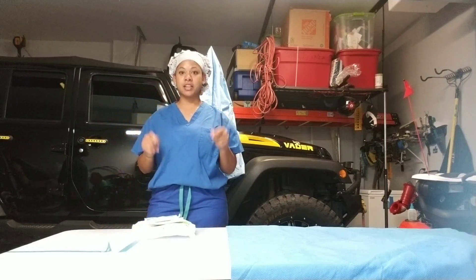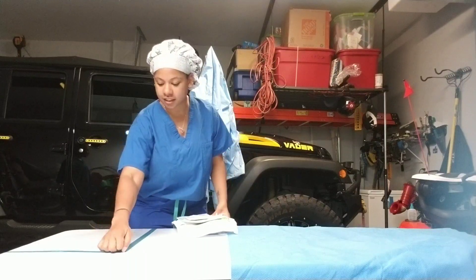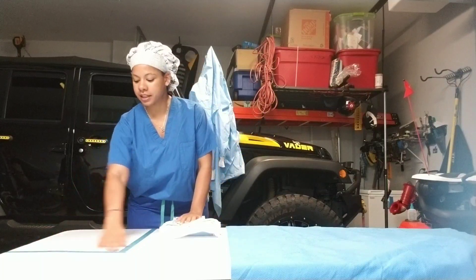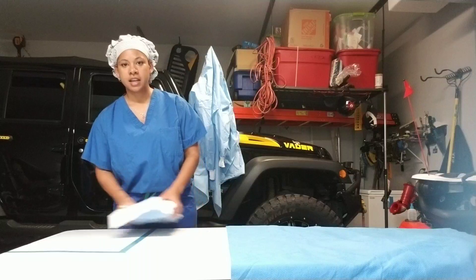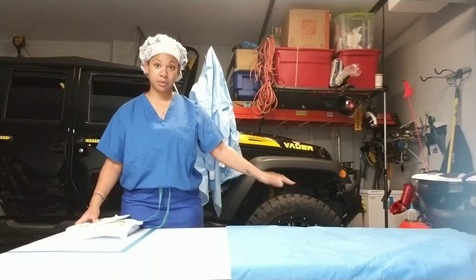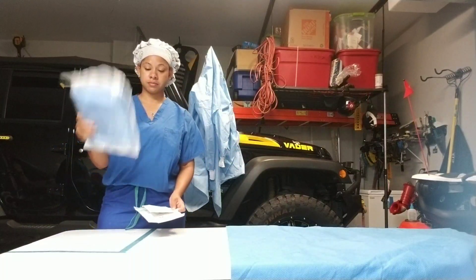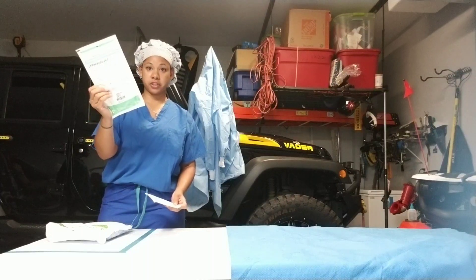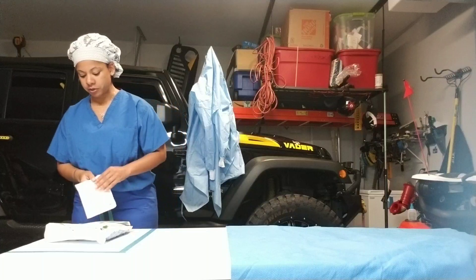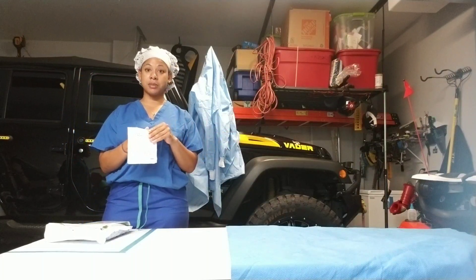We're going to do gowning and closed gloving with double gloves. As you can see here, my makeshift operating room — this blue line is representing my mayo stand and then this blue is representing my sterile back table. So I have my gown, my indicator gloves which are green, and then my top gloves. I'm going to open my peel pack sterile top gloves onto my sterile back field.